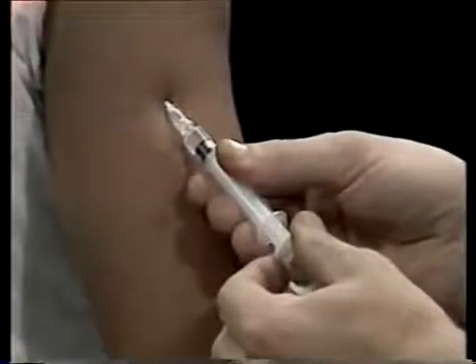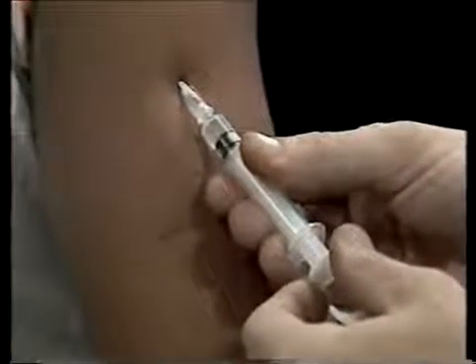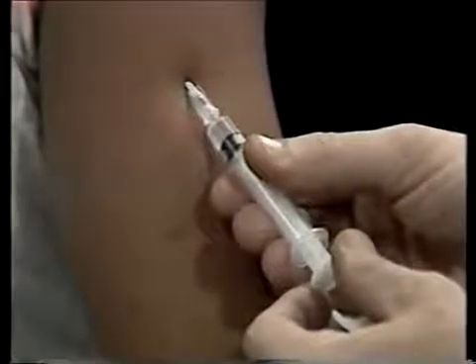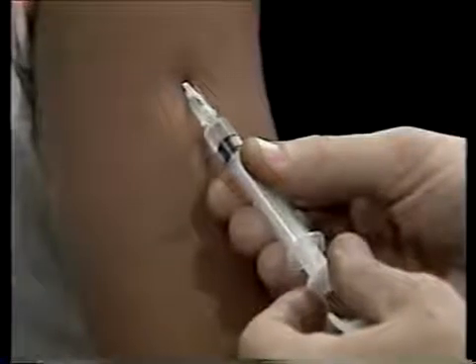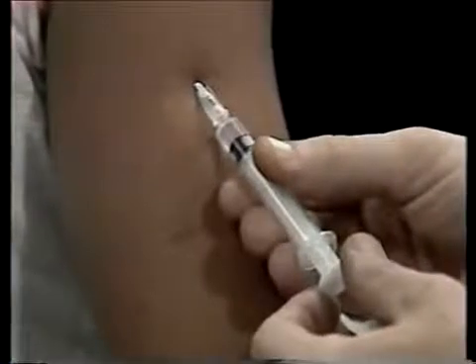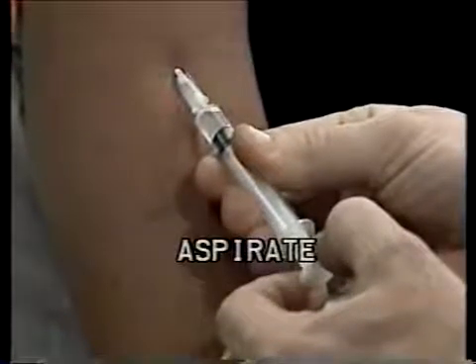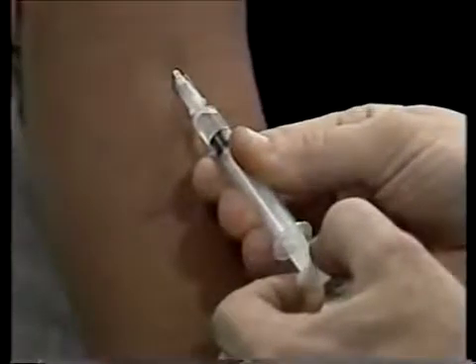Now comes a very important precaution. The purpose of this type of injection is to introduce medication to the blood-rich tissue under the protective skin, but you never want to inject medication directly into a blood vessel. The medication might injure the blood vessel — it could even cause shock. Therefore, draw the plunger back a bit, or aspirate. If you have hit a blood vessel, some blood will appear in the syringe. If blood appears, withdraw the needle and start again.